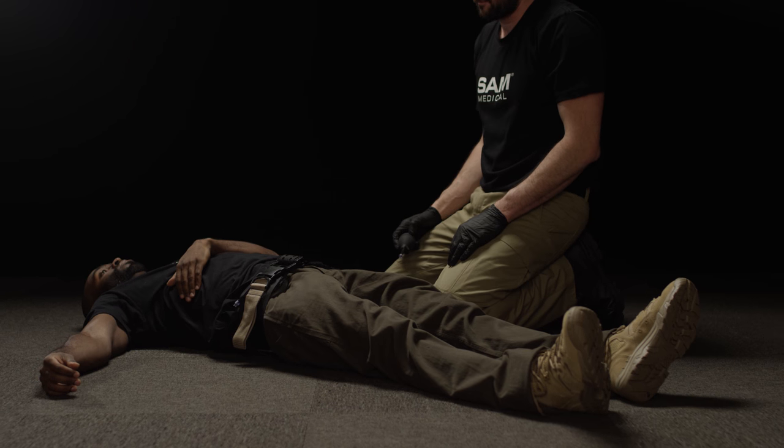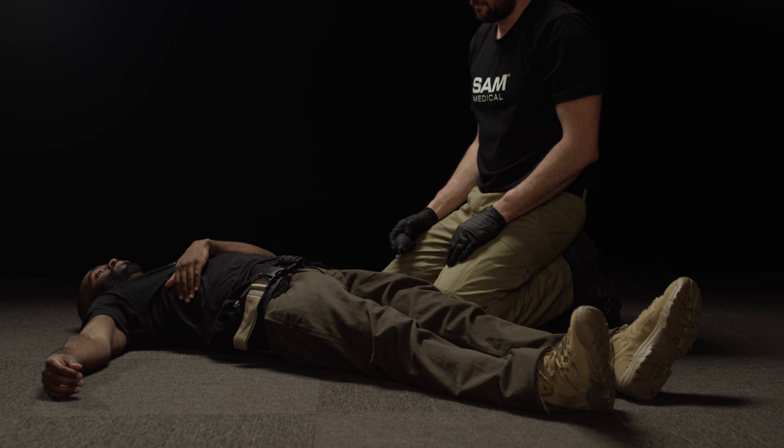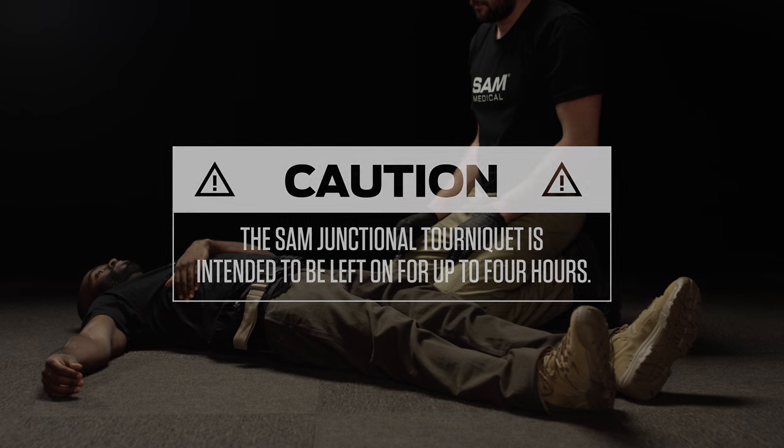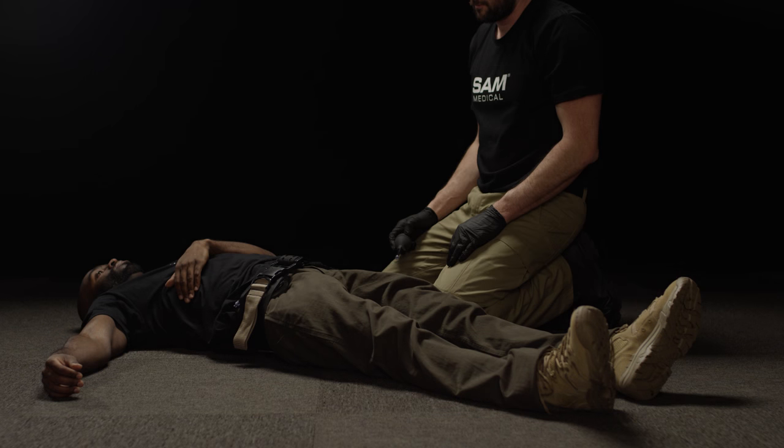Continue to monitor the patient during transport for hemorrhage control and adjust the device if necessary. The SAM Junctional Tourniquet is intended to be left on for up to four hours. Remove only at a definitive care facility.